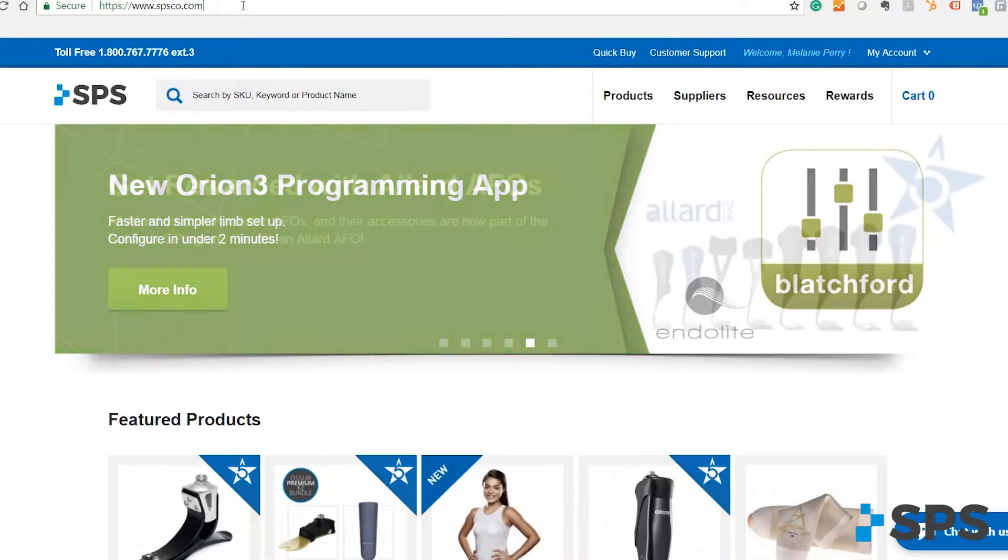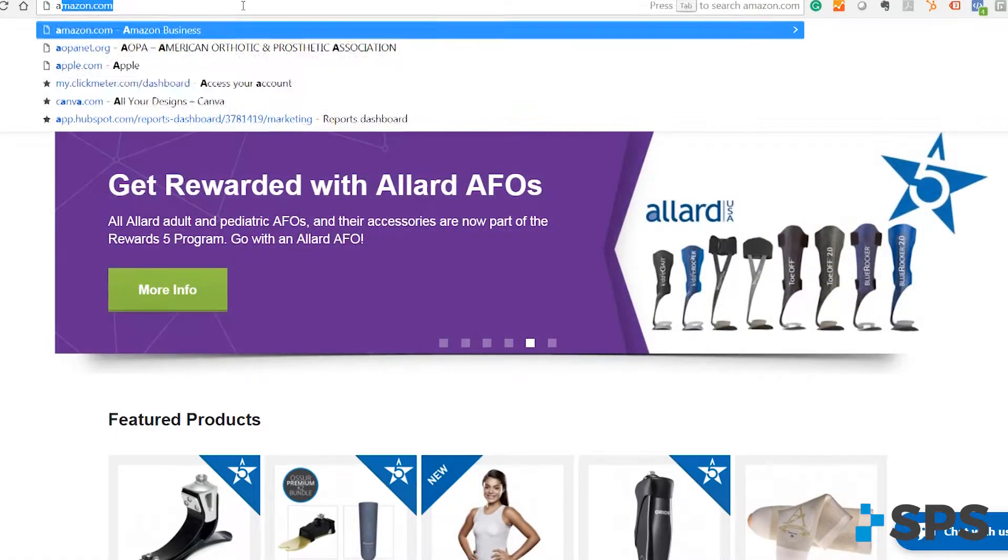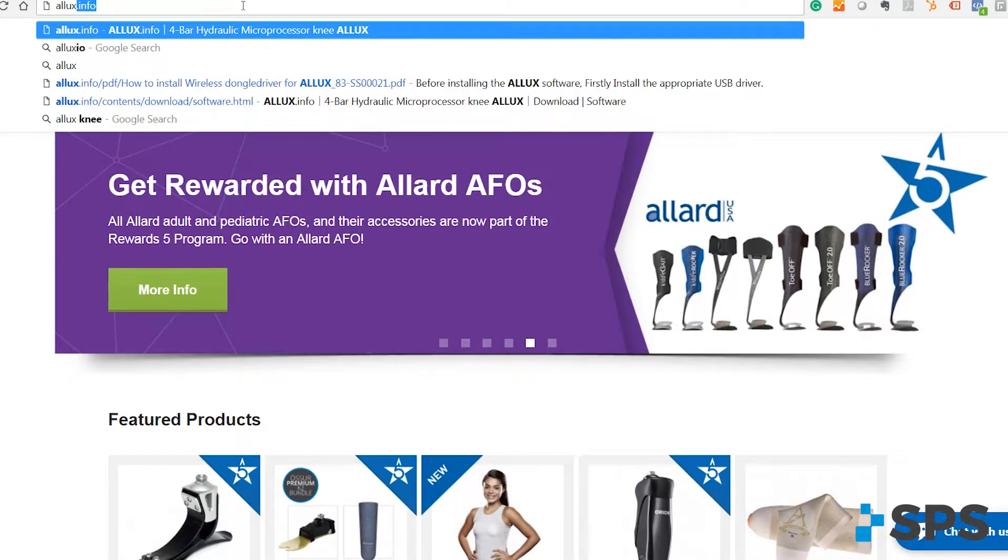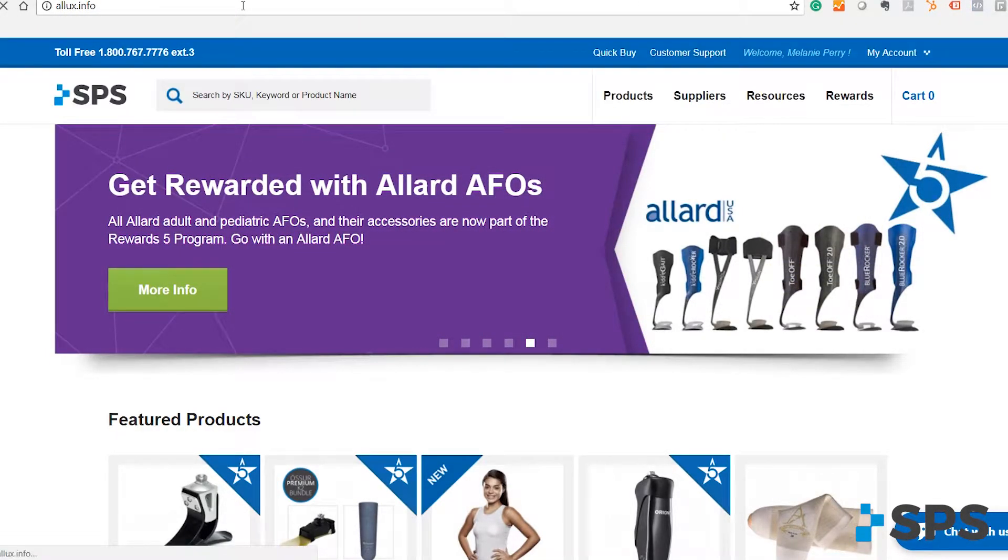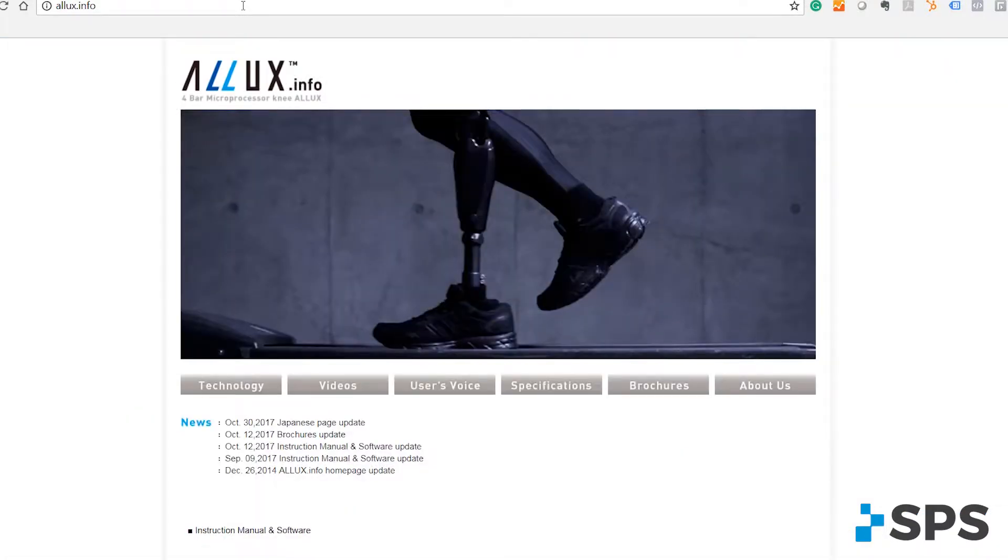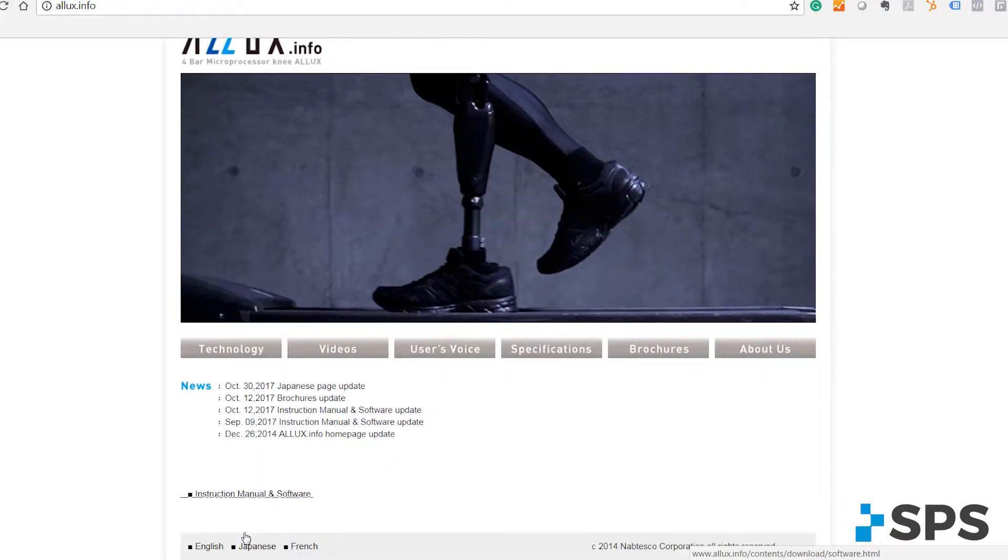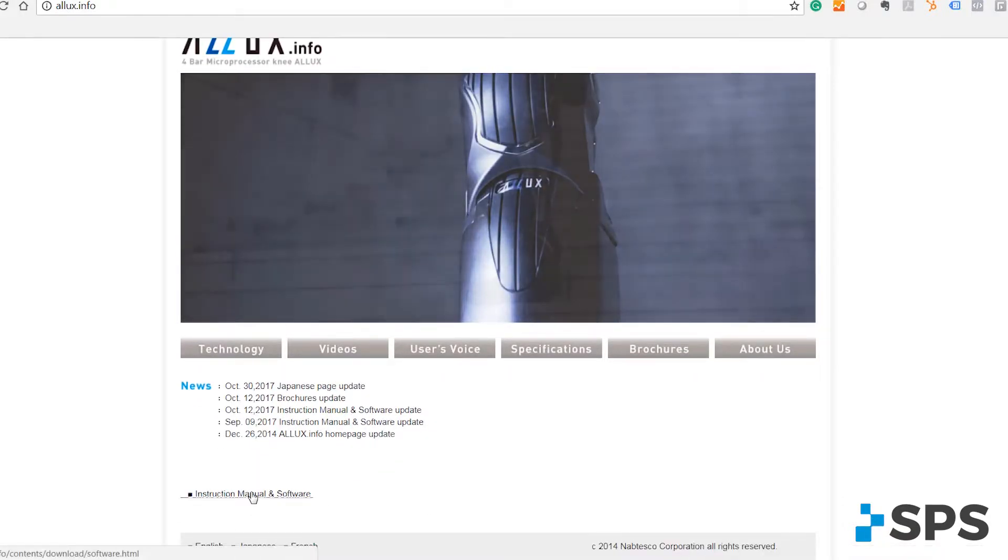Alright, in your browser screen type in allux.info. That will bring you to ALLUX website where you can actually download the software, dongle drivers, and also other documents and manuals.